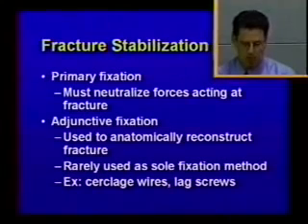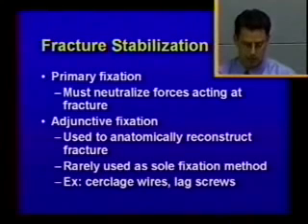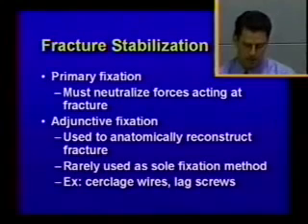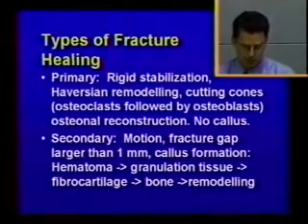For fracture stabilization, the primary fixation must neutralize all the forces that are acting at the fracture site in order to achieve healing. It's often combined with some sort of adjunctive fixation, such as positional screws or cerclage wires, and these are used to anatomically reconstruct some of the smaller fragments. These adjunctive fixation techniques are rarely used as the primary fixation technique.